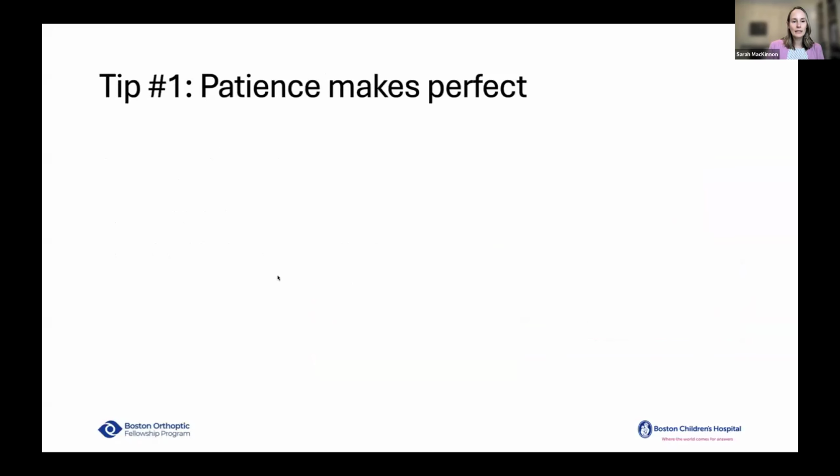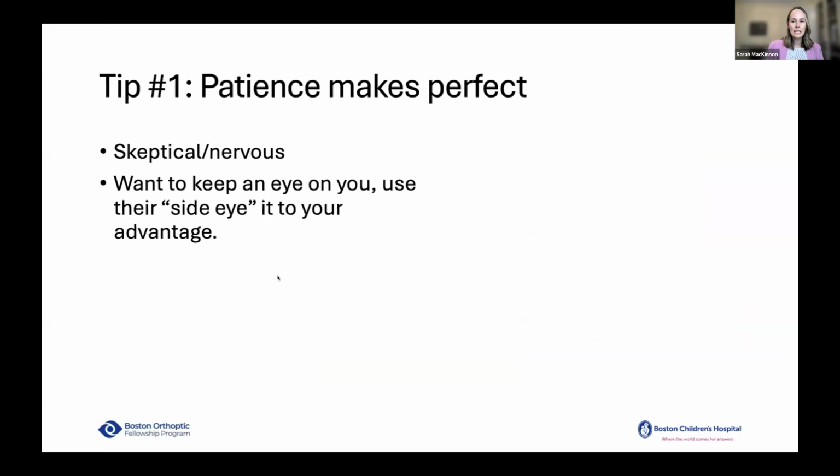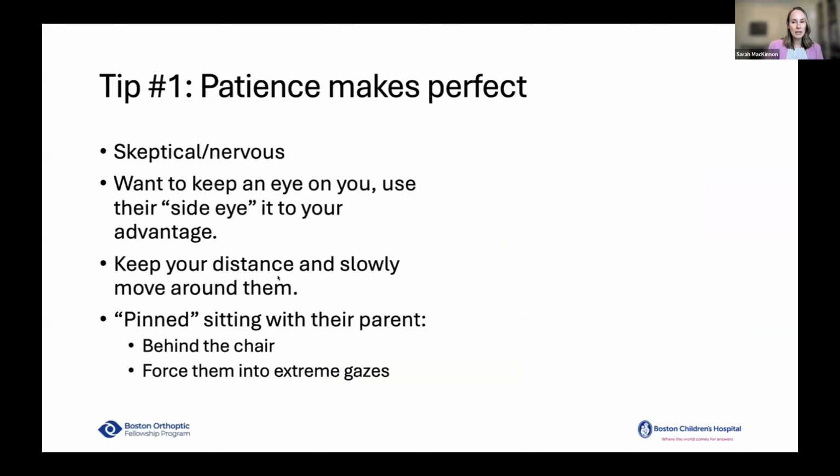So tip number 1 is patience makes perfect. Our young patients often need some time to settle into their exam, and rightly so, many are apprehensive of us and the entire experience. They often want to keep their eyes on you as the new person, and we can use their sideways looks to our advantage. I'll often just keep my distance and slowly move around them. If they're kind of pinned by sitting on their parent's lap in the chair, you can go behind your exam chair and it may force them into some extreme gazes.